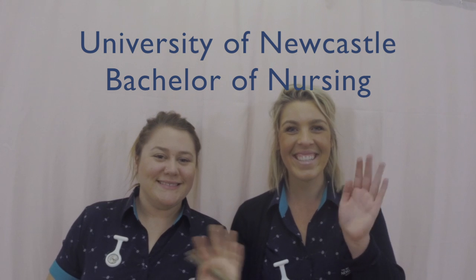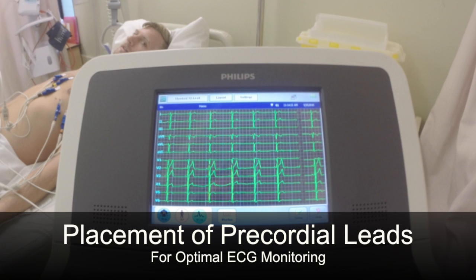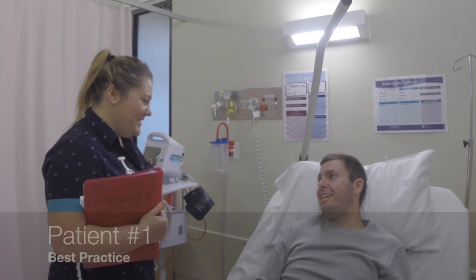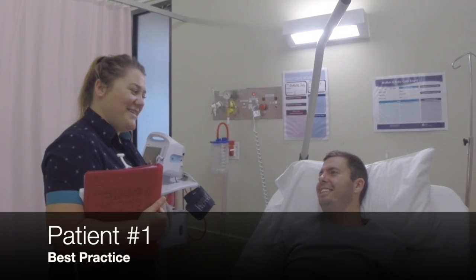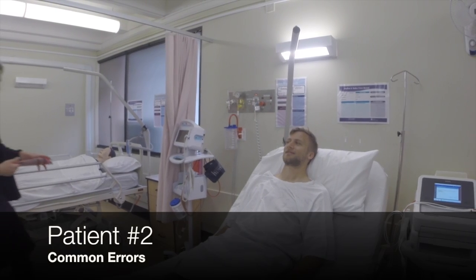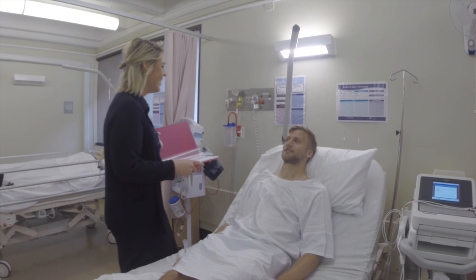Hi, I'm Brooke and I'm Ashley and we're third-year students from Newcastle University. This learning resource demonstrates how to apply a 12-lead electrocardiogram, also known as an ECG, to obtain an accurate tracing of the heart's electrical activity. In this video there are two examples of applying precordial electrodes. The first patient is a representation of best practice according to the evidence-based research, and the second patient is an example of how common errors can lead to inaccurate tracings and misdiagnosis.